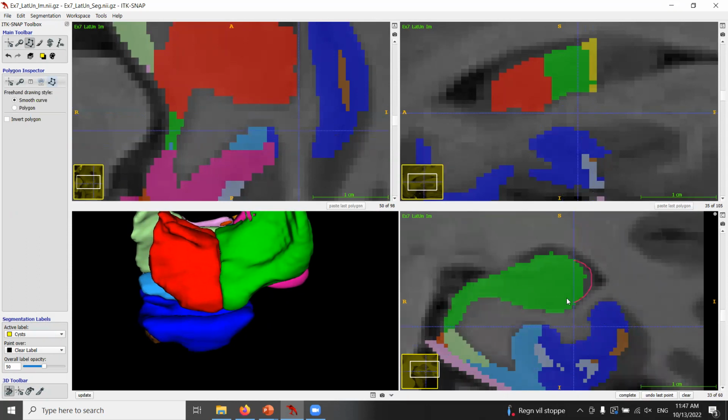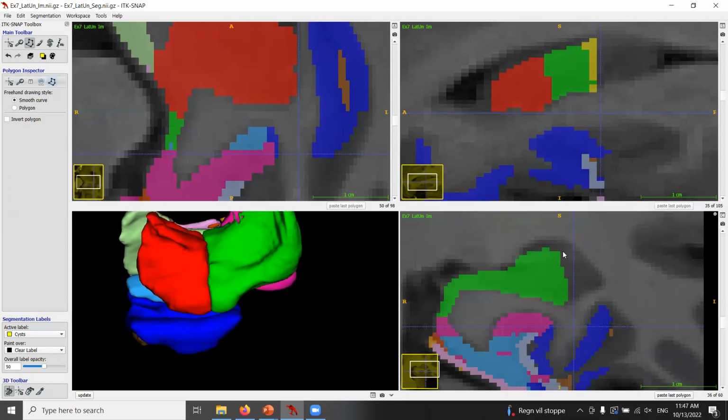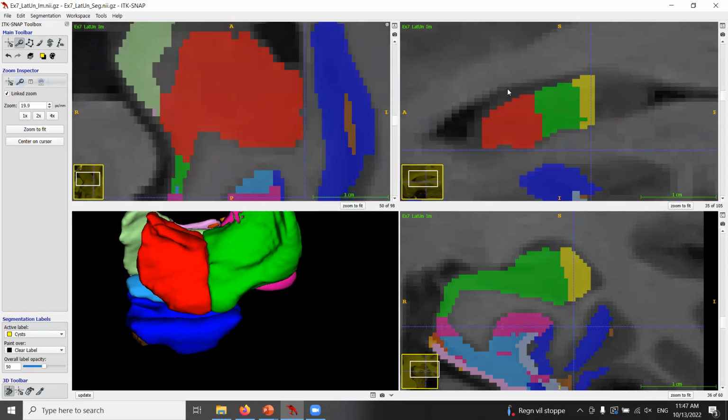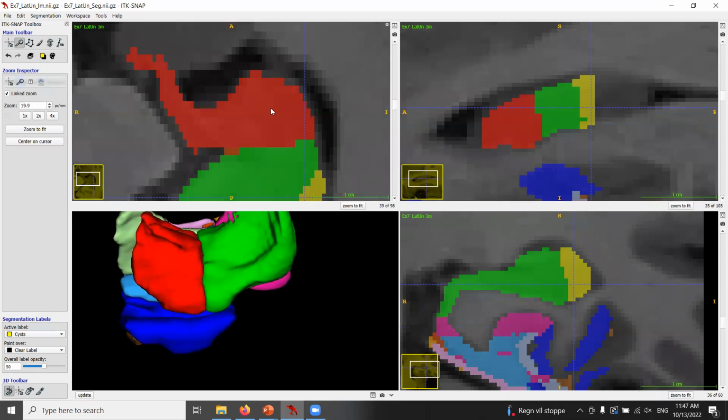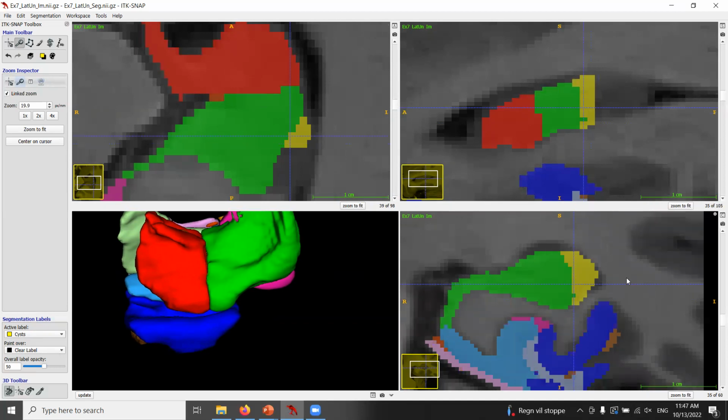And the reason why I would maybe pick another label now is because then it becomes easier to check in the other planes and to see if it still looks okay in, for example, the sagittal or axial plane. And then you can make sure that you're only editing and removing stuff again. If you're not super happy with the yellow label, you can remove it, but then you can make sure that you're not touching any of the other colors.